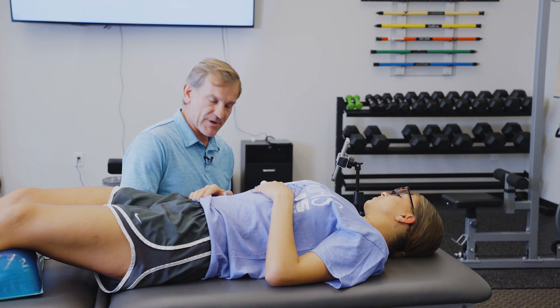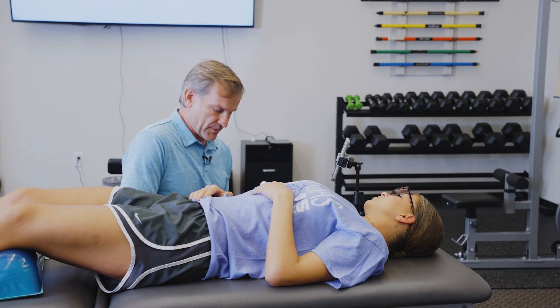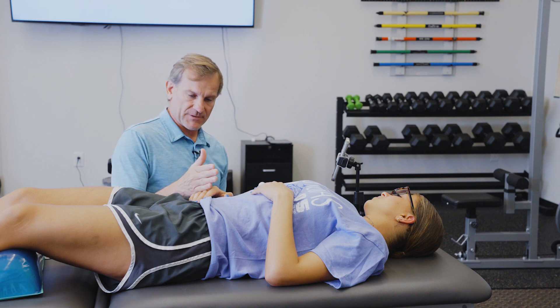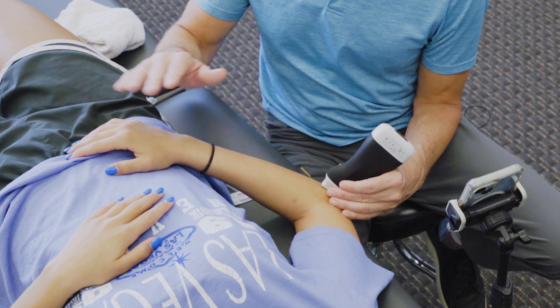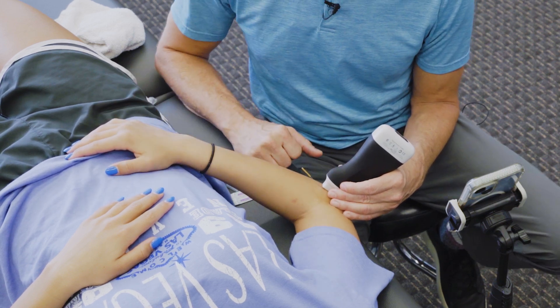First, we're going to look at some basic structures in the elbow, then get the patient set up for the dry needling procedure. We're going to have the patient in the supine position with the medial elbow on the table and the hand on the hip, so the elbow is at about 75 to 90 degrees.